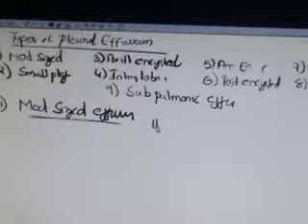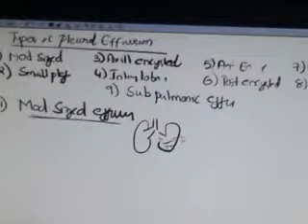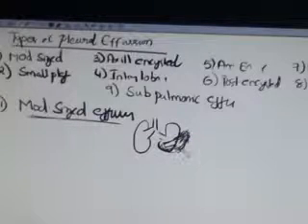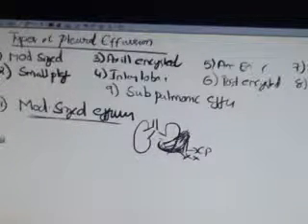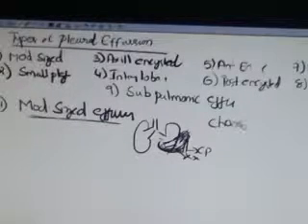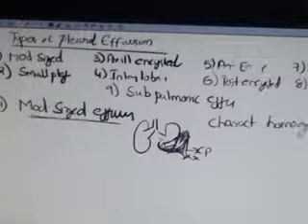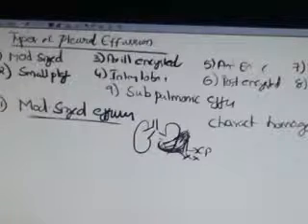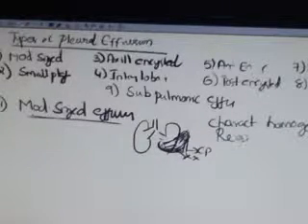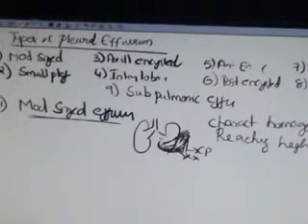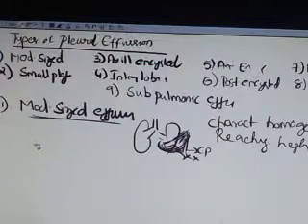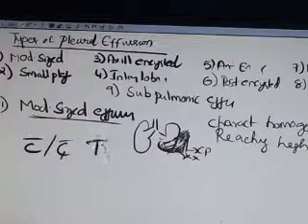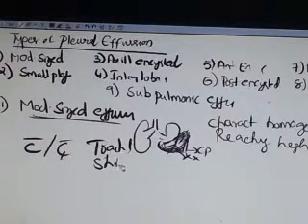As the name indicates it is of moderate size and you can see the classical fluid level here where concavity high up into the axilla with obliteration of CP angles and domes of diaphragm. Here you can see the characteristic homogenous shadow reaching high in axilla with or without tracheal shift.